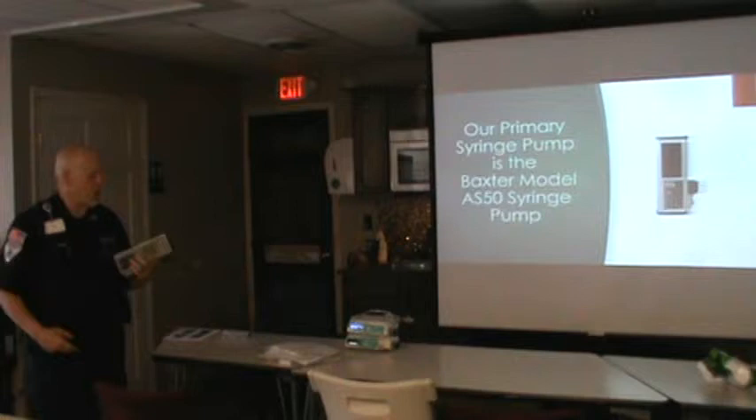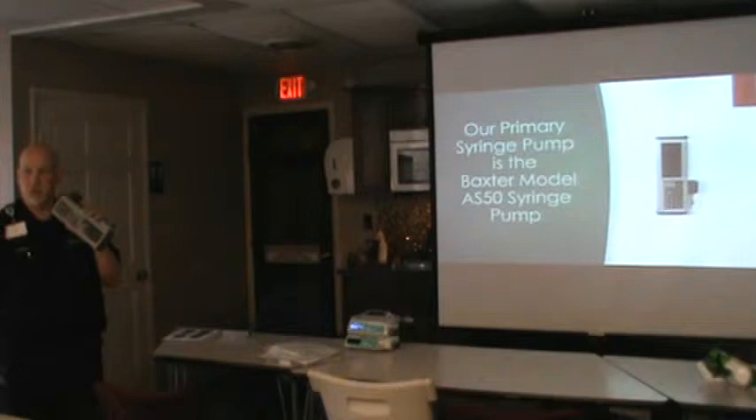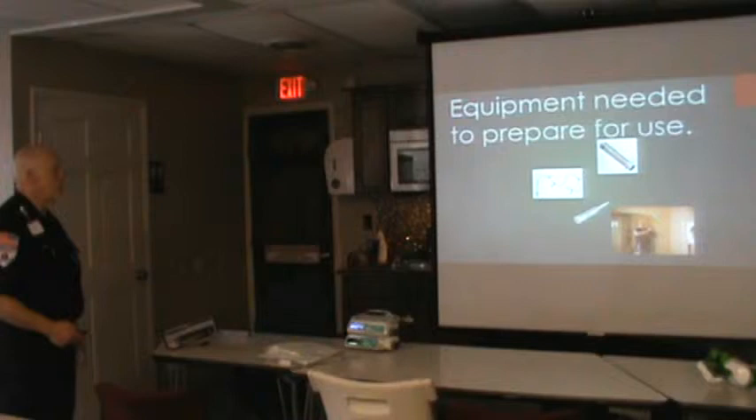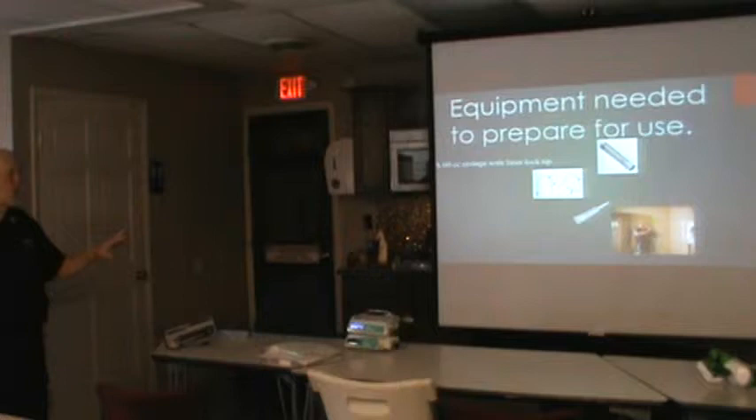Our primary pump is this wonderful old Baxter pump that we've seen over the centuries. The equipment you need for it is very minimal. What we need is a 60cc syringe usually — you can go with smaller syringes because different size syringes can be mounted in it. You're going to be asked what company makes the syringe, so look at the paper — BD.